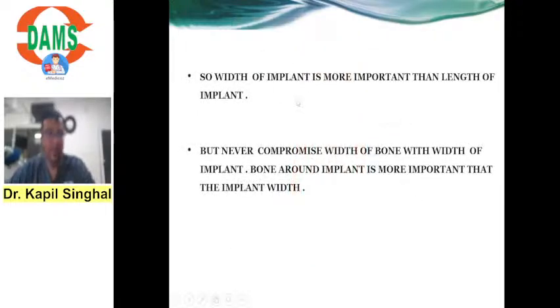Okay. Now next important point, very important, please remember. The width of the implant is more important than the length of the implant. Please remember, a 0.5 mm increase in width of the implant increases the surface area of the implant by 15 to 20%.